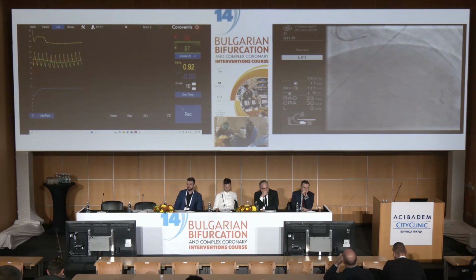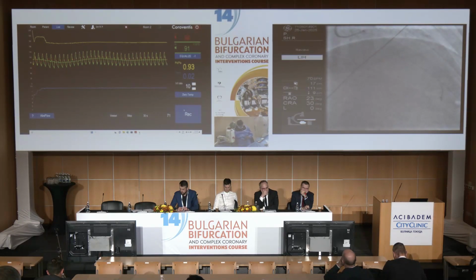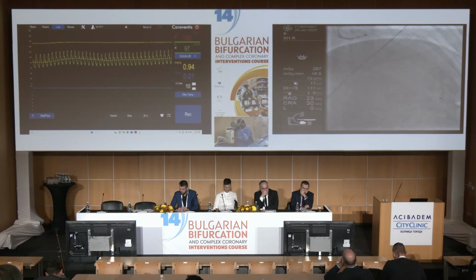And in the meantime, Tabo and the nursing staff here has changed the programmation of the pump. We are no longer giving 10 milliliter per minute, but we are going to give 20 milliliter per minute. Okay? You follow? We are going to zero the temperature to make sure that you see that the zero has remained very close to the zero, so there is no drift in temperature.